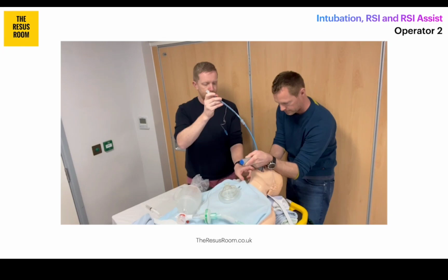Now it's just worth saying at this point, sometimes the bougie gets held up on the plastic connector at the end of the tracheal tube. And just to sort that out, you can apply a little bit of pressure to straighten out the bougie within the tube, and often that allows the tube just to continue sliding down.